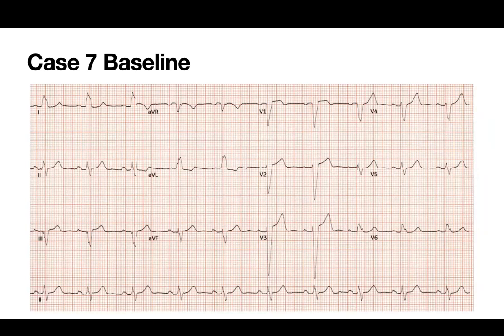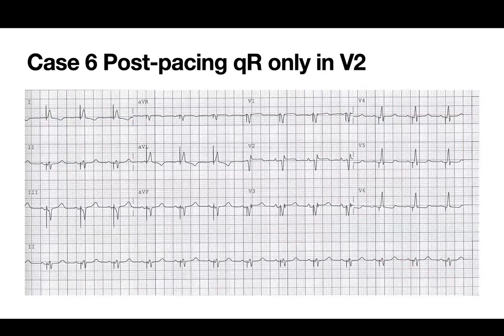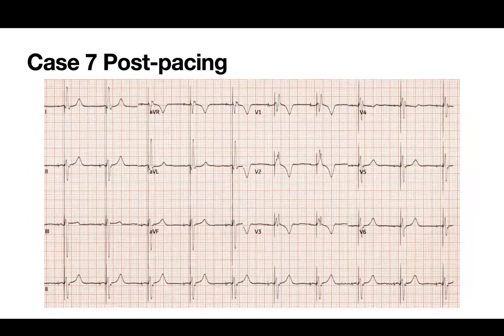Okay, go next. Is that the one or no? There was another one too. I'm going to show the other case after this one, a combination. Go next. So this is the post-TAVI one that went into QR. Okay, go next. This one too went into complete heart block when we were positioning, and you see this is what you get after, and then at follow-up is fusion.